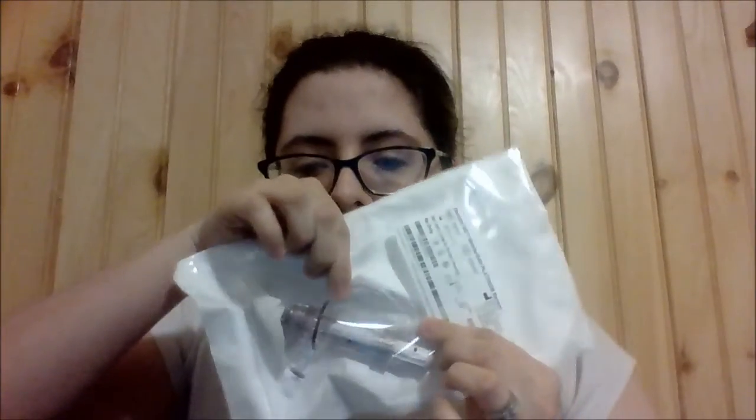And I can show you the little sensors. Alright, so these are my sensors with the inserter. This half octagon, I believe the shape is. I'm sorry, I'm bad with shapes. Is the remover. I use it to remove my transmitter from my sensor. And then obviously the needle part is what I use to insert. My husband helped me with my arms because I'm just starting. Sorry, out of breath again.